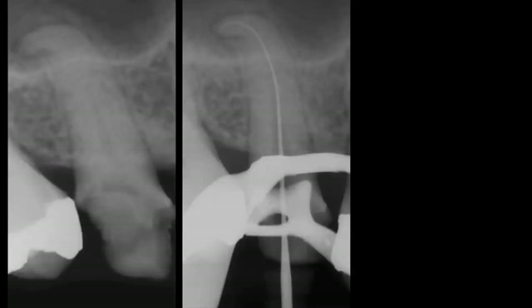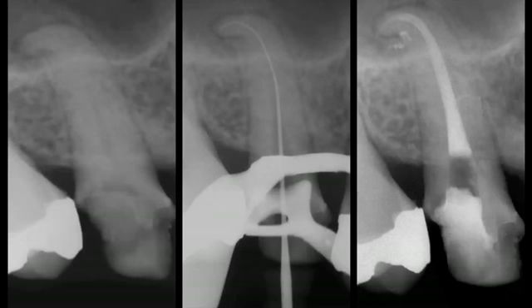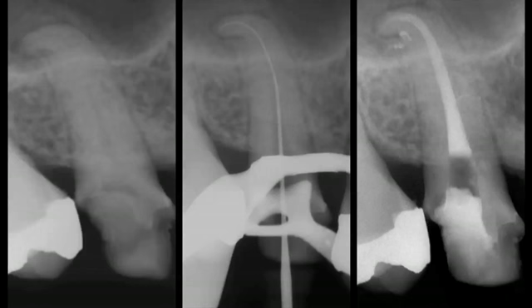Well-shaped canals promote three-dimensional cleaning and filling root canal systems. Let's radiographically evaluate this maxillary second bicuspid for endodontic treatment. From a restorative standpoint, note the recurrent decay and that the clinical crown has been extensively prepared. Endodontically, the pulp chamber has receded below the crest of bone and the root is dilacerated in its apical one-third. I have found that endodontic performance improves dramatically when we use the strategy 'start with the end in mind' — try to visualize the post-treatment result on the pretreatment film. We need a treatment plan, a mechanical strategy, and the best and most proven instruments available.